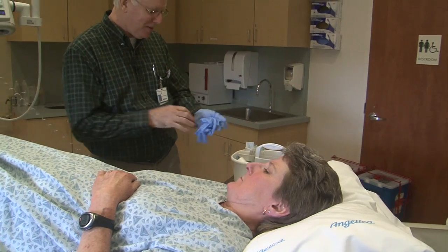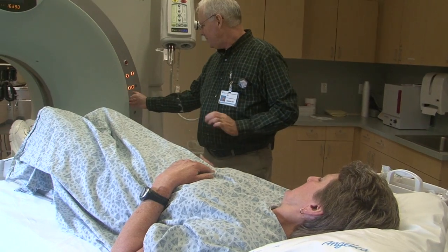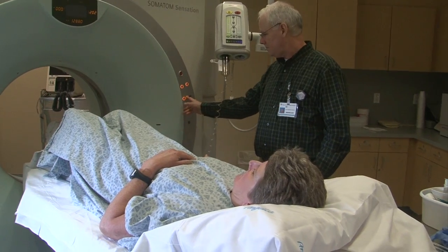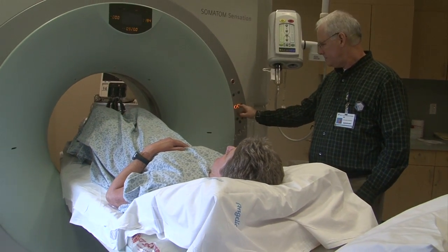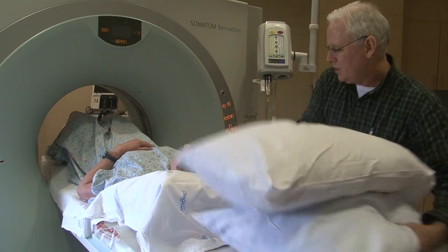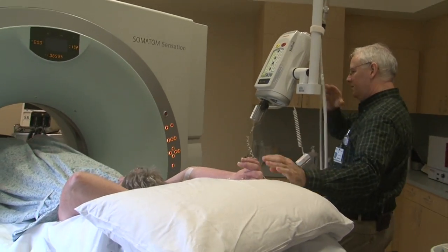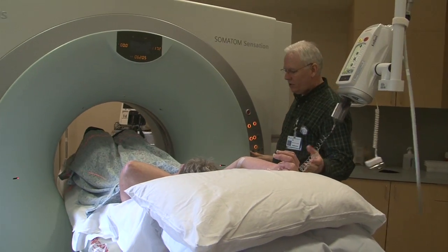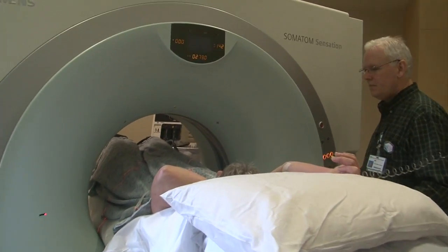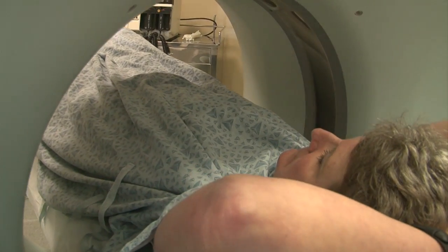Are you ready to go? Sure. Here we go. I'm going to wrap this tube around your thumb a couple times, move you into the machine. I'd like you to put your arms above your head and keep this one rather straight. There you go. Close your eyes for just a moment. And just listen for the instructions now.